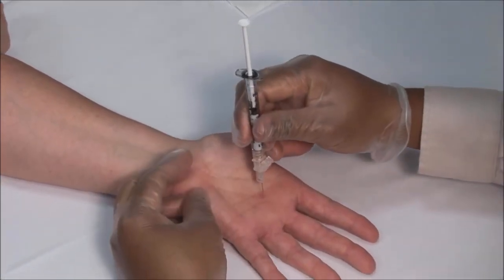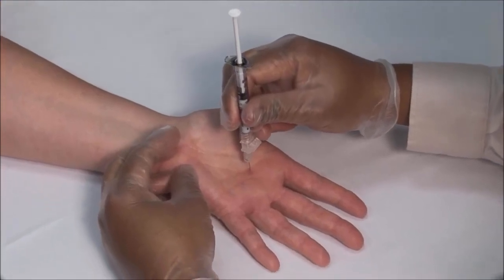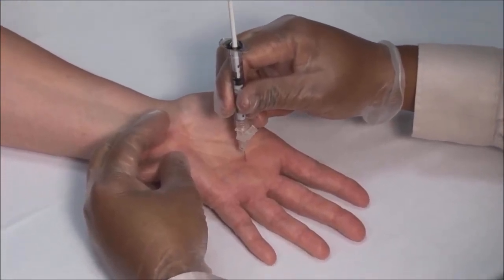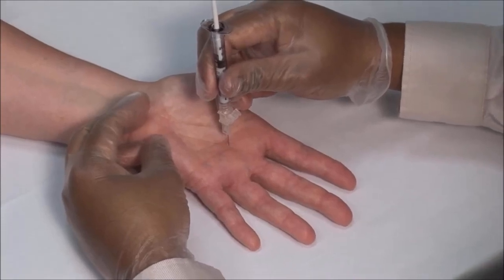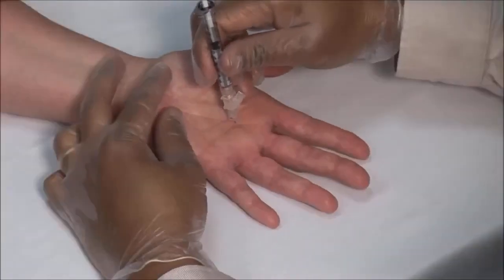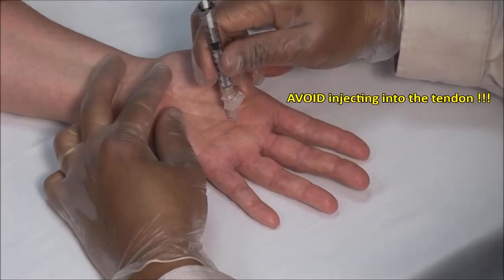Advance the needle vertically down towards the tendon sheath. It should go in about one and a half centimeters. Remember that injection must not be done within the tendon.